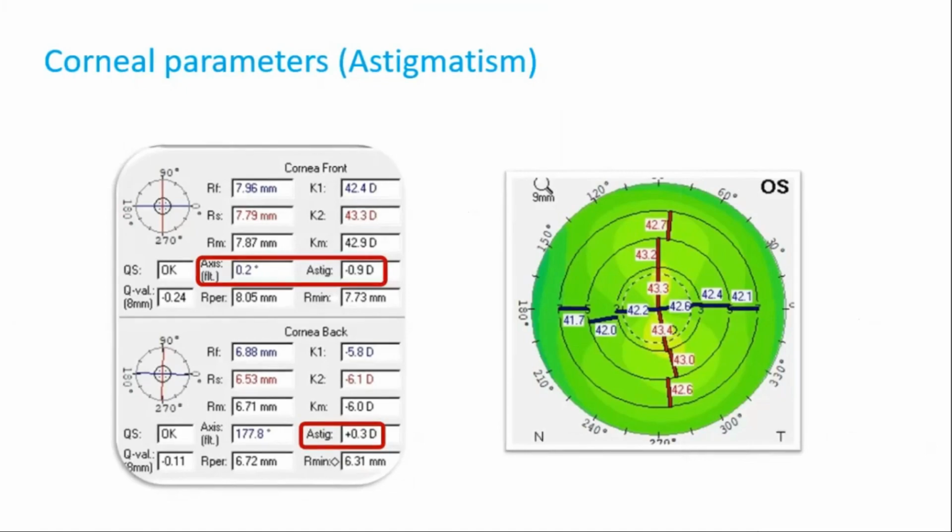Also, since you spoke about the posterior cornea's astigmatism, what is the utility of measuring the cornea's back surface? Where does it come in useful, and up to what limit is astigmatism considered okay on the posterior cornea? Generally, this helps us especially in toric IOL calculations, to know the impact of the posterior corneal astigmatism on the total corneal astigmatism.